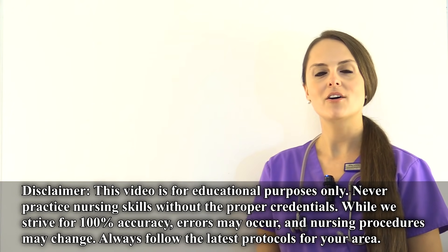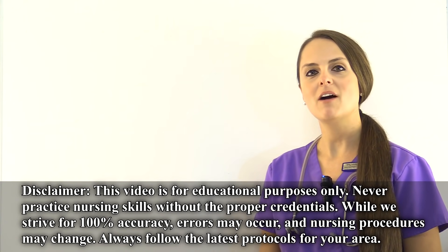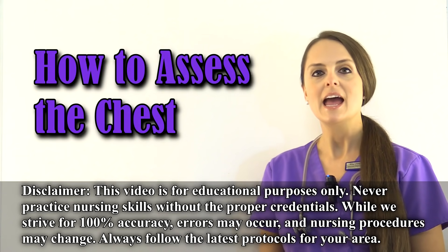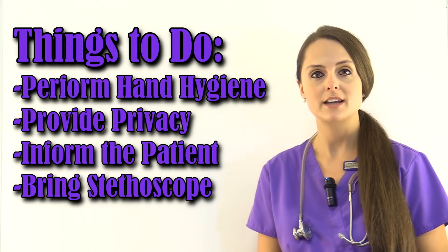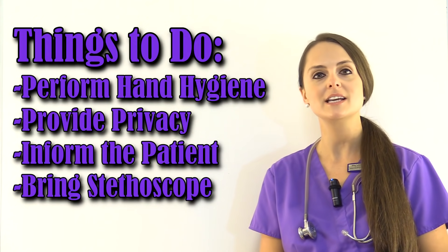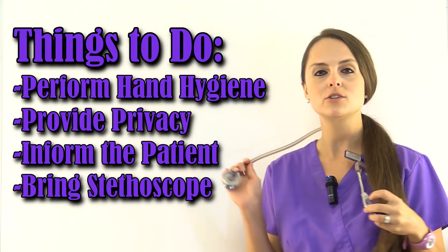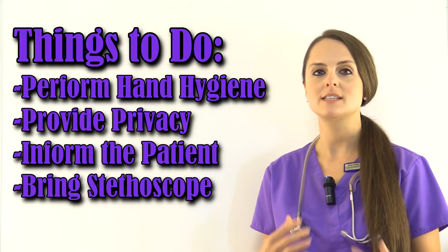This is Sarah with RegisterNurseRN.com and in this video I'm going to demonstrate how to assess the chest. If you'd like to watch a complete nursing head-to-toe assessment, you can access the card in the corner or in the YouTube description below. To do this skill, you'll need to perform hand hygiene, provide privacy to the patient, tell them what you will be doing, and grab your stethoscope.